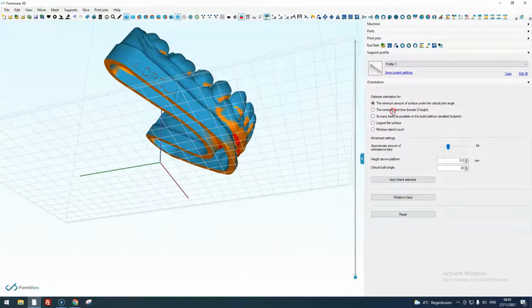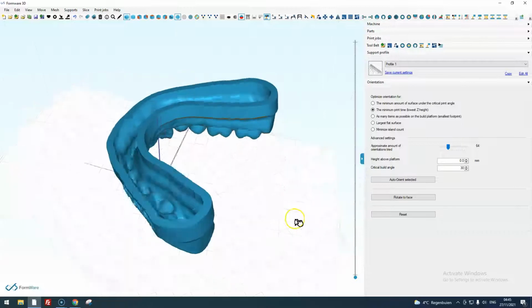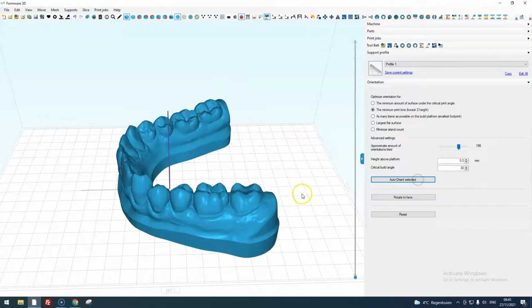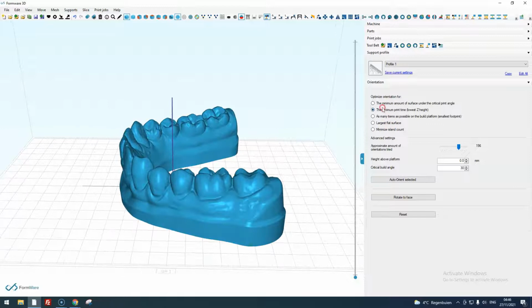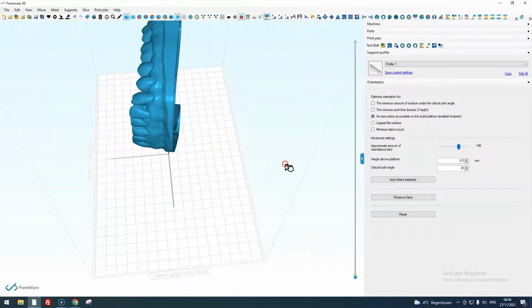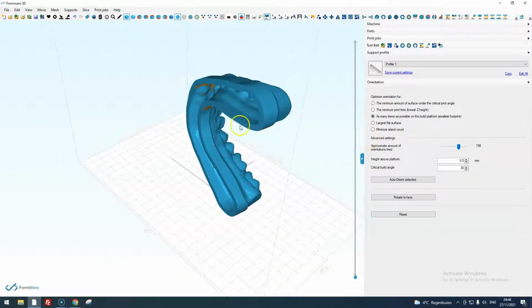Now the next option would be the minimum print time. So this is basically orient for the most flat part. We might want to increase the amount of orientations right here. And then you'll see it actually puts it flat on the build table. Then there's the option as many items as possible. So the smallest footprint possible. That will yield an almost vertical orientation.